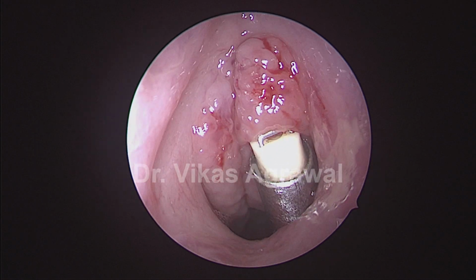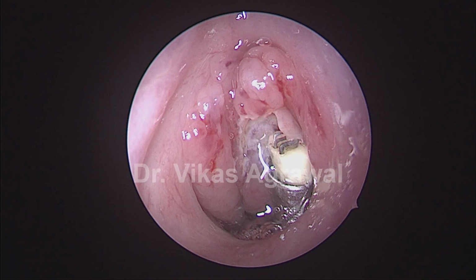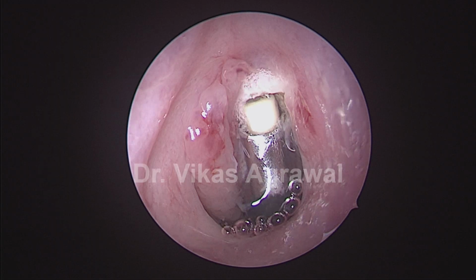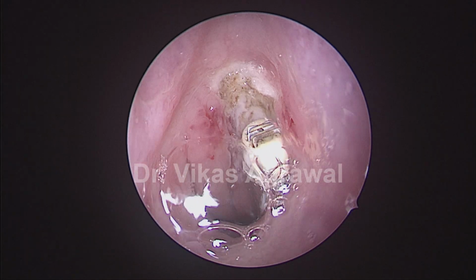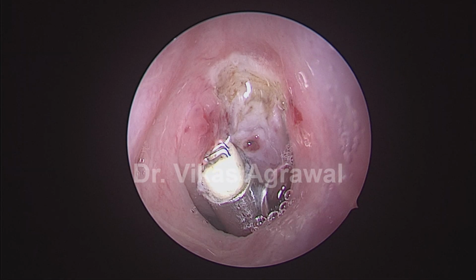So here you are watching coblation adenoidectomy in a 6-year-old child with obstructive symptoms. You can see they are grade 4 adenoids. I have already performed intracapsular tonsillectomy. Now I'm starting the adenoid from the superior pole. That's the superior boundary of the adenoid, which is the periosteum below the sphenoid bone.